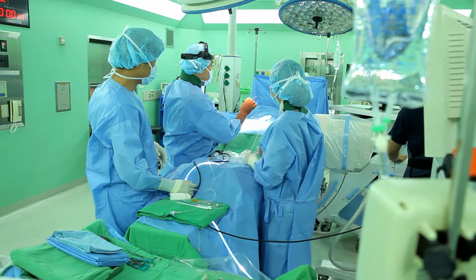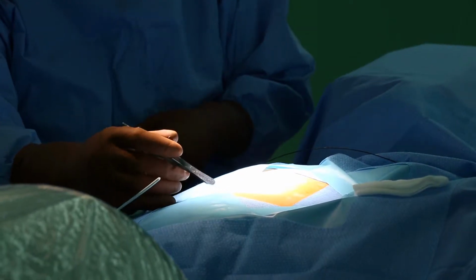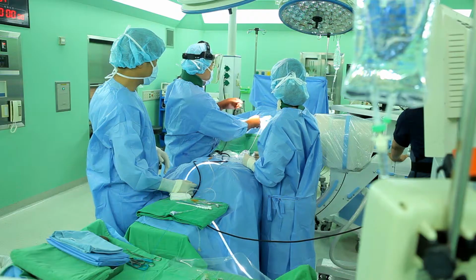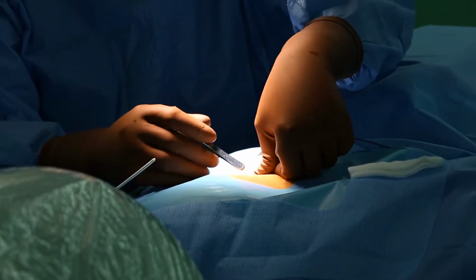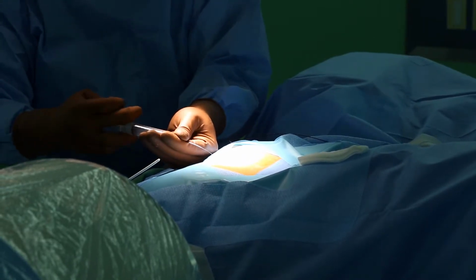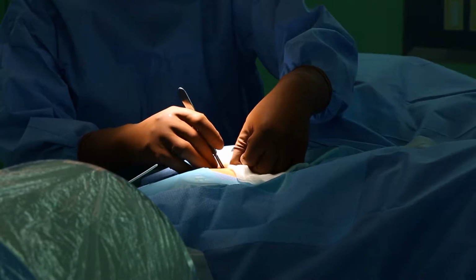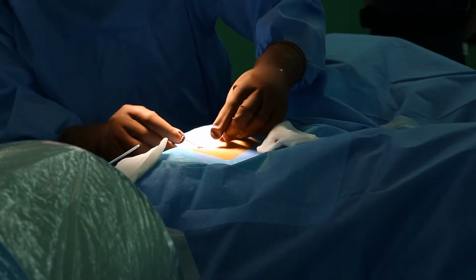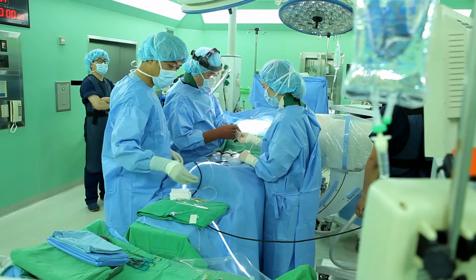You can see the approach procedure from puncture to getting to the target point. This part is the important process on which a successful operation depends. Look for the appropriate place to puncture in the area of the hiatus. Injection of the local anesthetic in the area of the hiatus. An epidural needle is inserted into the epidural space of the spine through the hiatus above the coccyx. Place the guide wire into the hiatus through the needle.